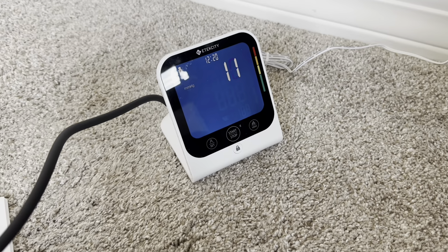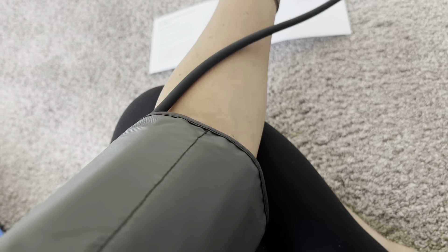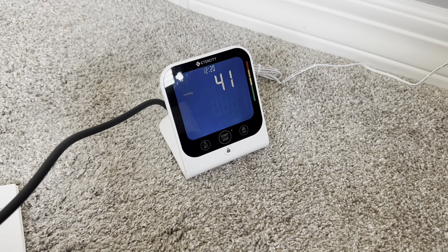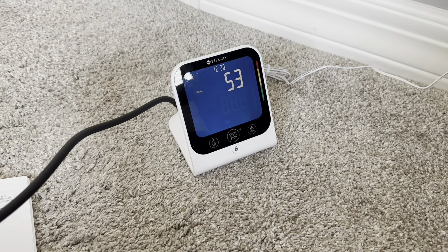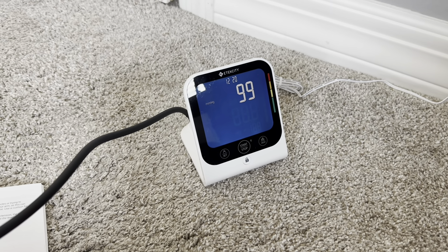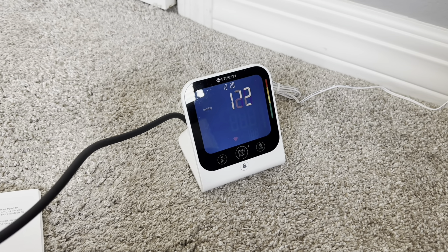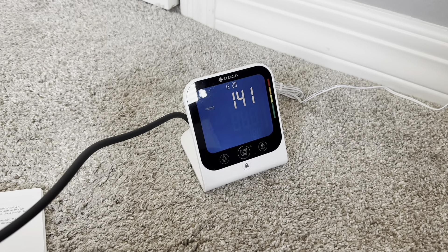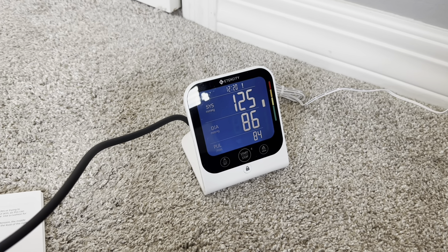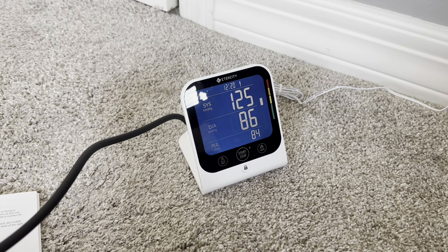So I have it plugged in. As you can see, I am taking my blood pressure right here. We'll go ahead and let it track. And that's pretty much in line with what I usually get from my doctor.